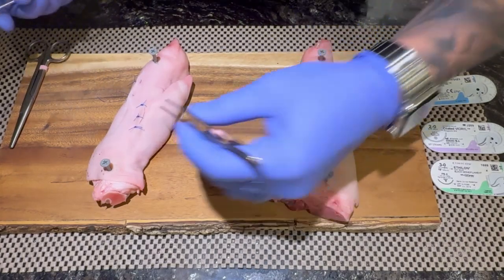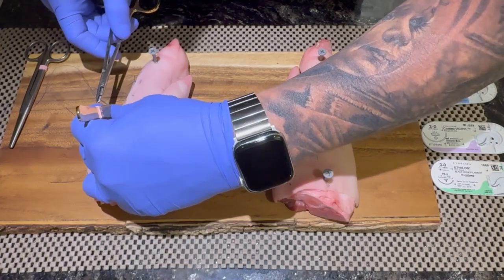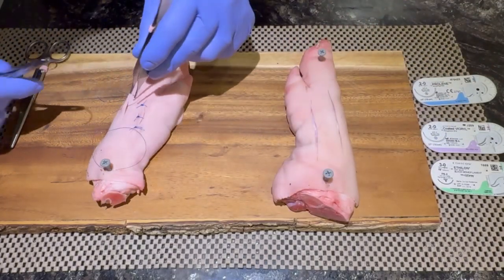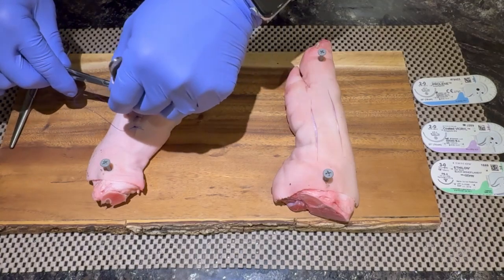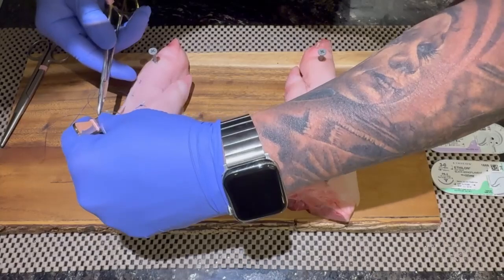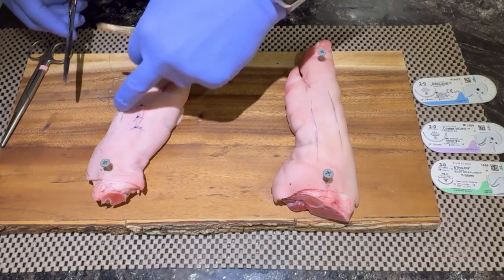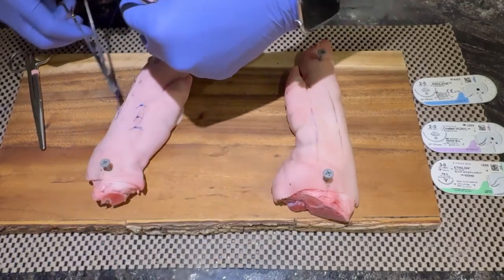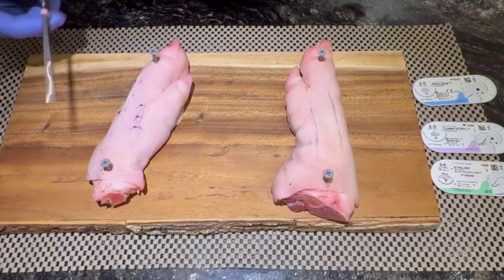We can also have a half buried stitch, where we go the same distance from the wound, but on one side we keep it out, from the outside to the in. Then it's a combination of a mattress and a subcuticular. We run a subcuticular, pull it through, and then go back and go outside. And then we tighten the knot on the other side. Then we have the half buried.